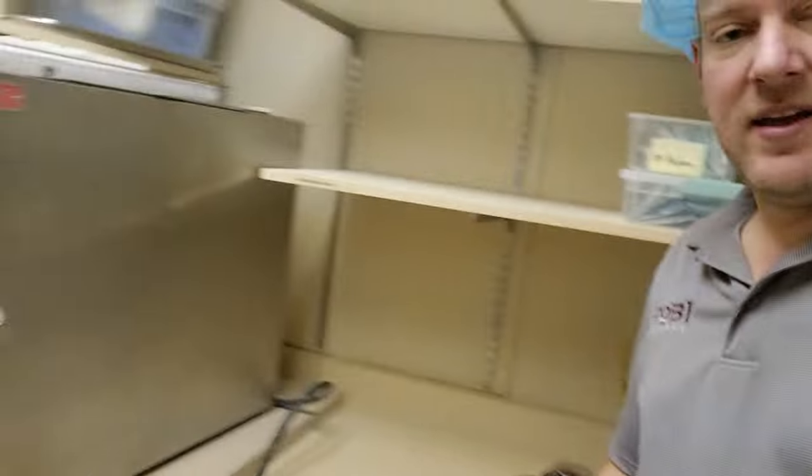I'm at a clinic, and you know, clinics don't get as much love as hospitals do, but when things go wrong, they can go really wrong. And I'm here with a MagnaClave. This MagnaClave mysteriously would not power up. It's been shut down for the better share of a month, and now that they want to do surgeries tomorrow, it won't power on. Let's go ahead and take a look and see this very interesting problem.